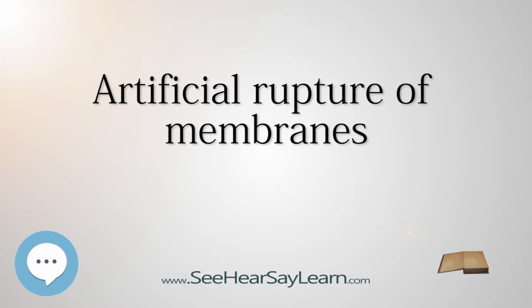Artificial rupture of membranes, AROM, also known as an amniotomy, may be performed by a midwife or obstetrician to induce or accelerate labor. The membranes may be ruptured using a specialized tool, such as an amnihook or amnicot, or they may be ruptured by the proceduralist's finger.